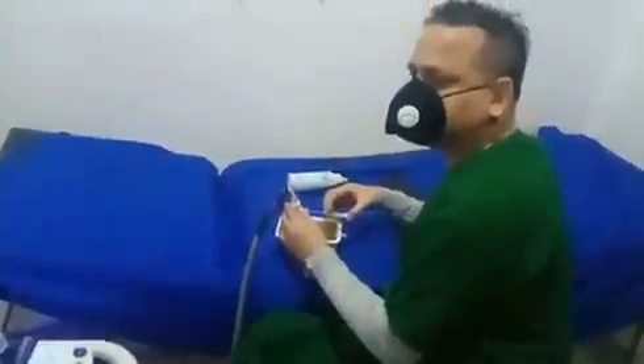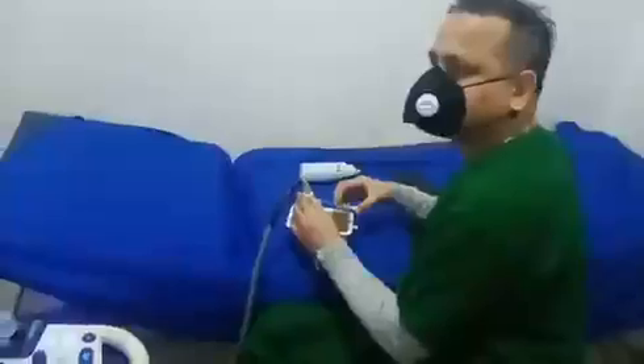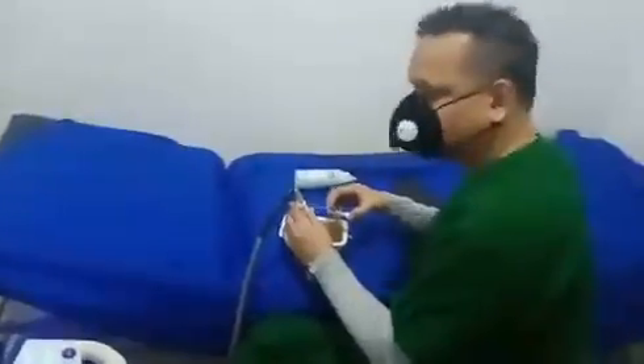Hello, I am Dr. Abarth Johan and today I am going to demonstrate ultrasound guided peripheral venous access in the genetic model.